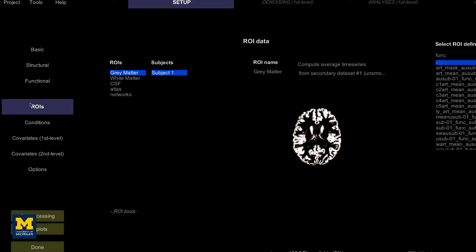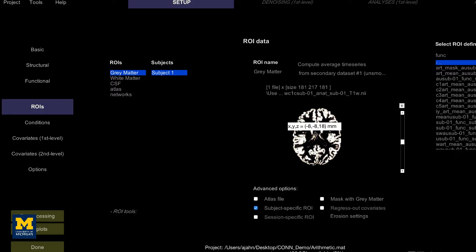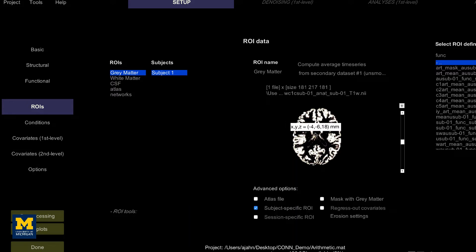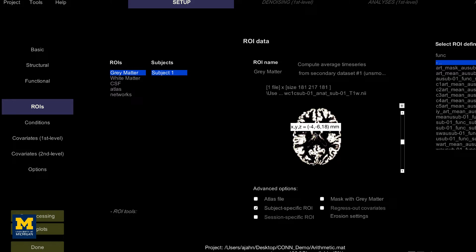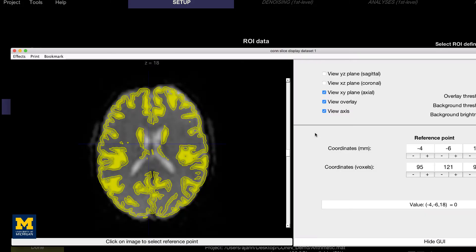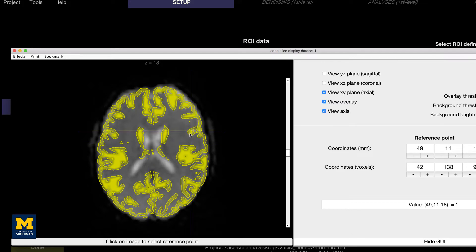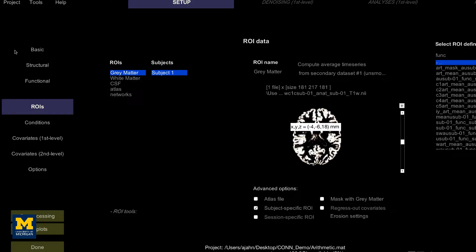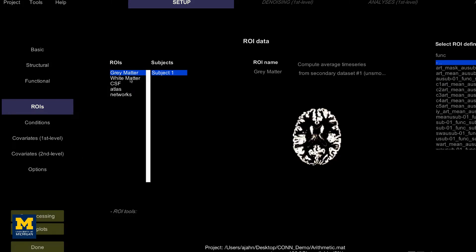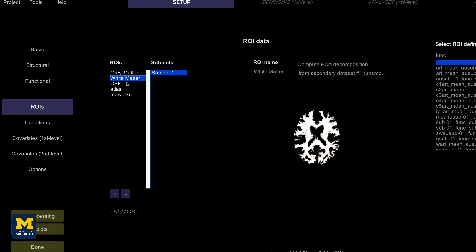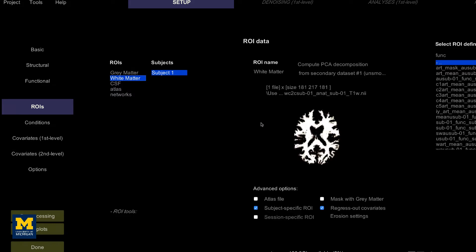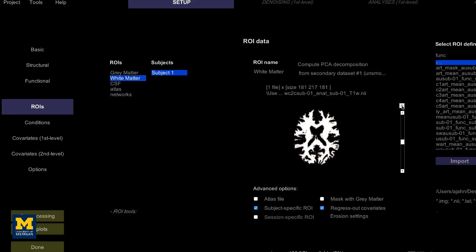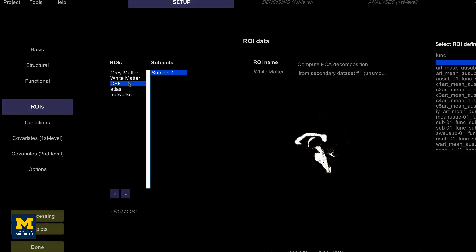Let's begin with the first three, which correspond to the tissue types that make up the brain. Clicking on any of these slices will open up a montage window that you can use to more closely examine the overlap between the gray matter mask and the gray matter of the functional image. While you're at it, look at the white matter and CSF masks as well to make sure that they seem to have been segmented appropriately.